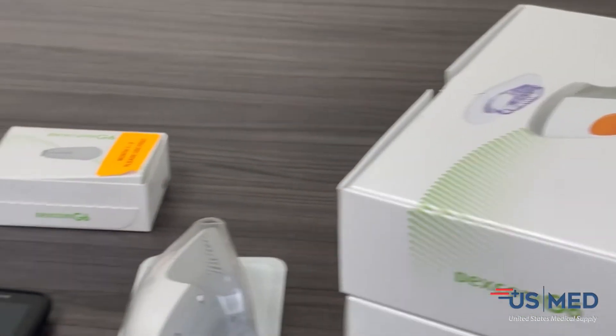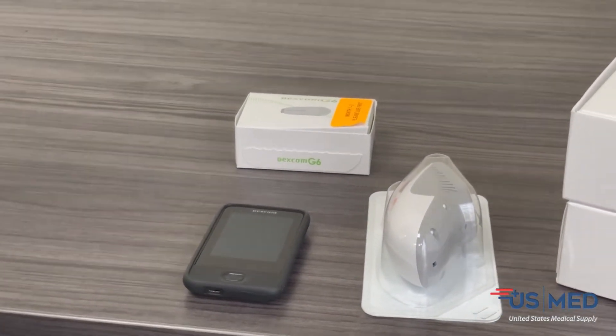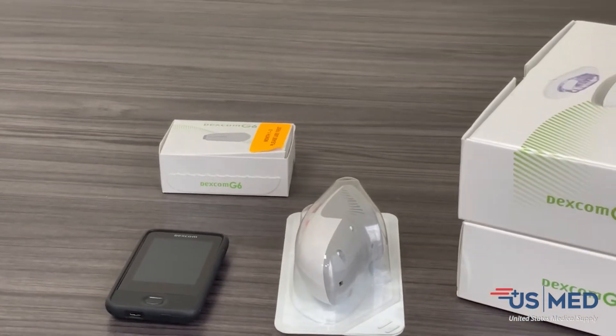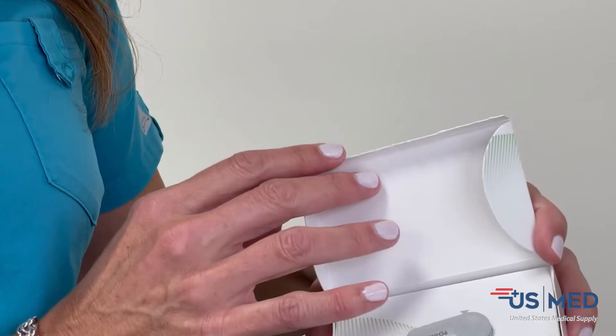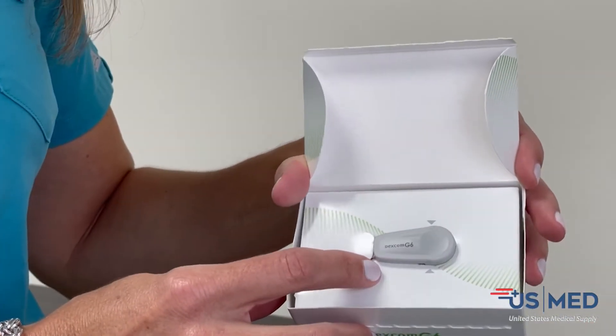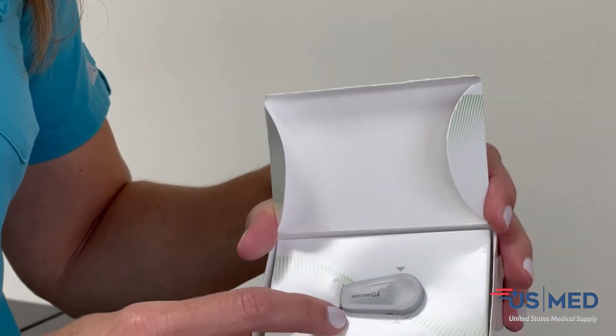You're also going to have a separate box which contains the receiver along with the USB cord for the computer and also an AC adapter for the wall as a charger. You're also going to have the Dexcom G6 transmitter — it's a separate box, and we send one transmitter every 90 days.